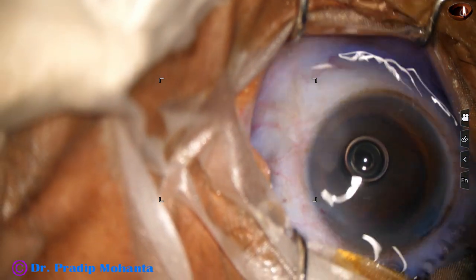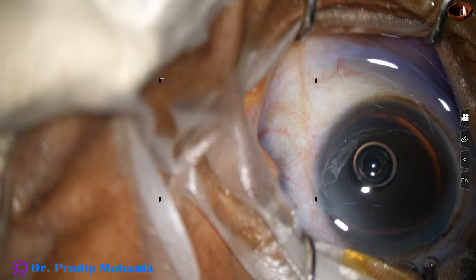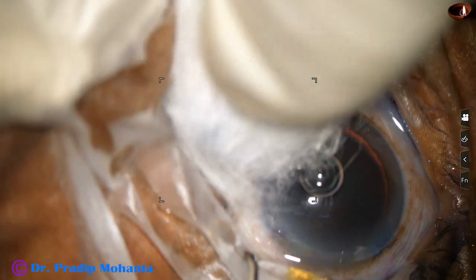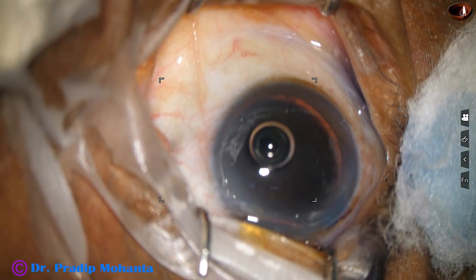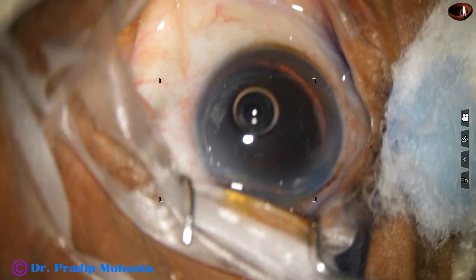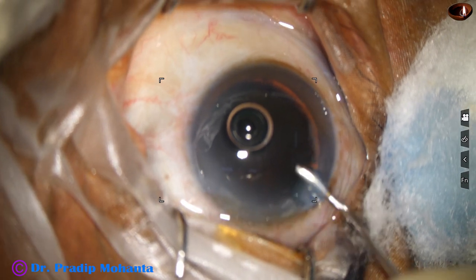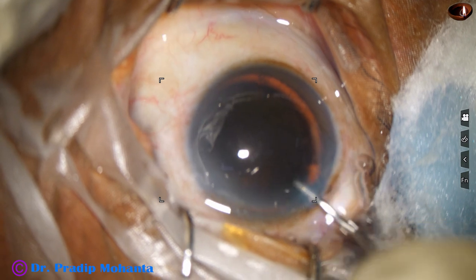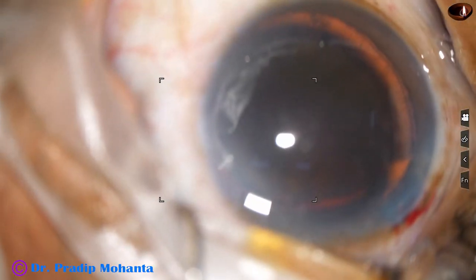And now the anterior chamber is filled up with a viscoelastic substance. In this case, this is 2% hydroxypropyl methylcellulose. Here goes the visco. And now is the time to do capsulorhexis.